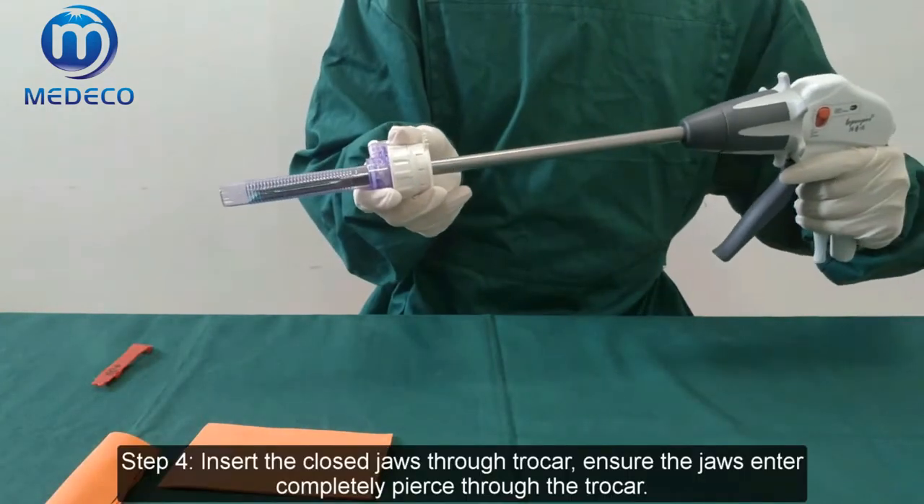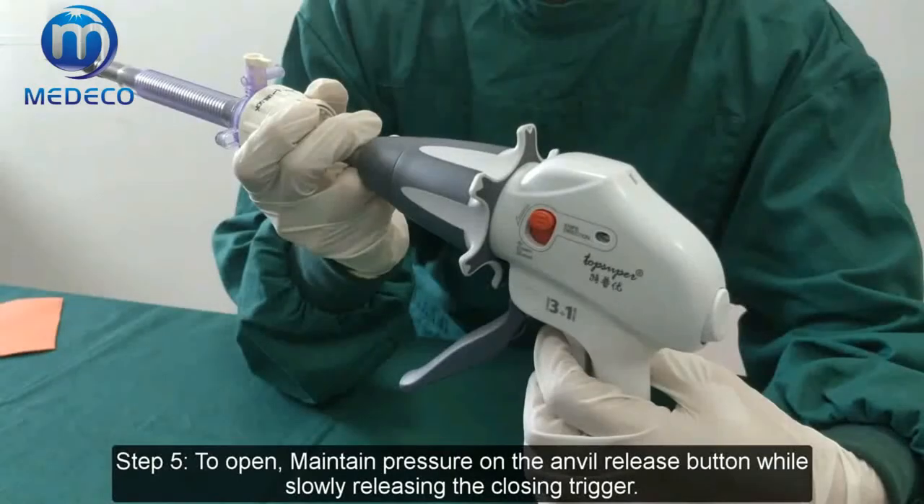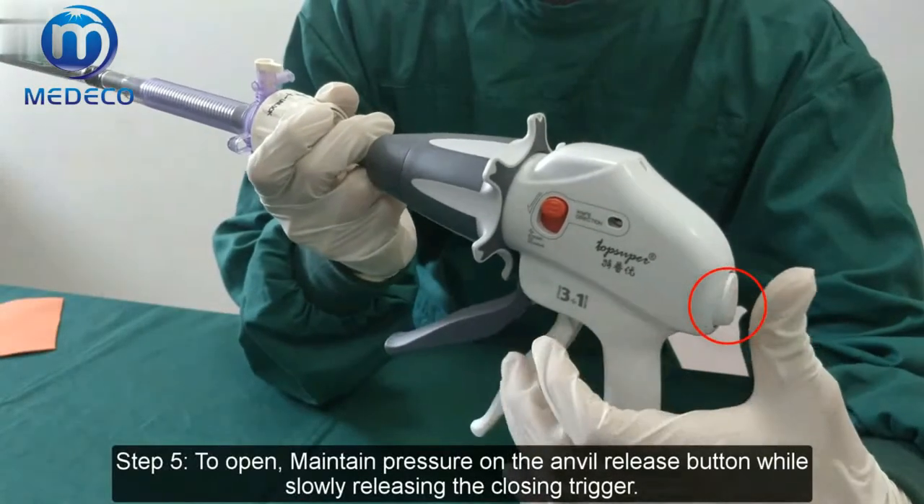Step 4: Insert the closed jaw through the trocar. Ensure the jaws enter completely and are pierced through the trocar. Step 5: To open, maintain pressure on the anvil release button while slowly releasing the closing trigger.